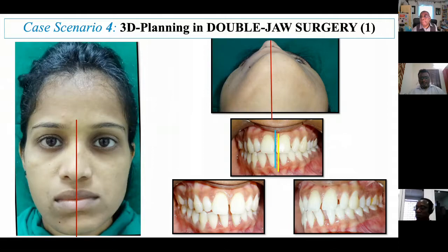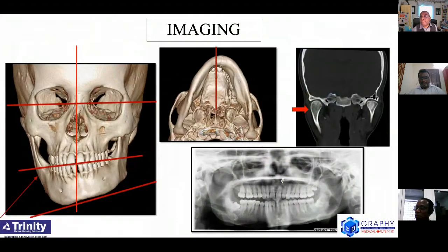And if you see the slide very closely, you can see that there is a certain amount of increased growth in the mandible. And if you see the bird's eye view where the patient is looking upwards, there is a definitive overgrowth in the mandible, or the lower jaw. And you see there is a slight shifting or drifting of the teeth towards that side. And this is the CT scan where you see that the entire mandibular plane has changed and is tilted towards the left side.